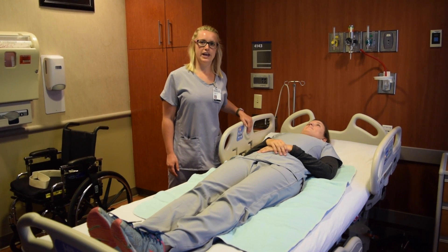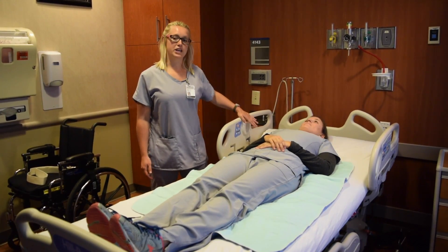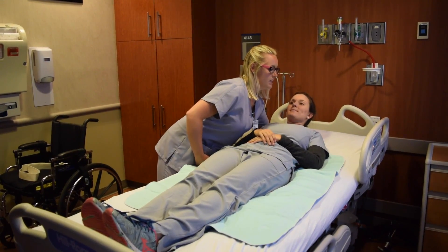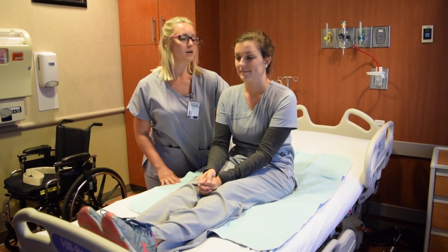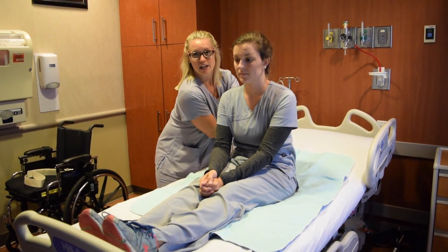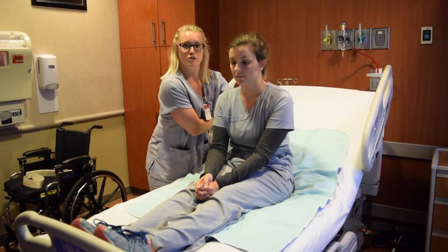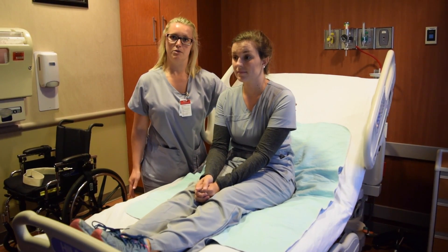When assisting a patient with a halo, you want to be sure to get the patient into a long sitting position before elevating the head of the bed. This will prevent the halo from getting caught in the sheets and disconnecting from the patient's head. Simply put an arm underneath the patient's shoulders and raise the patient up. You can ask the patient to assist if they have the trunk control to do so. Make sure that when you pull the patient up, you're not pulling on the wires of the halo. You can then elevate the bed. If the patient doesn't have the trunk control and you don't have the strength to maintain the patient, you can ask for another person's assistance. You will then use the same technique when lowering the patient.